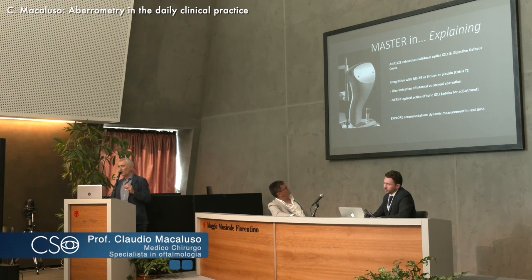We can study refractive IOLs very well, and it's very important because nowadays we are using more and more of these refractive, multifocal, EDOF, extended depth of field IOLs. So for the distributors, this is a huge potential market, but for us clinicians it is great being able to see objectively these optical effects.